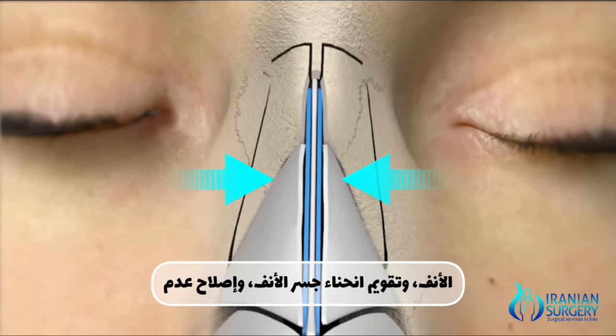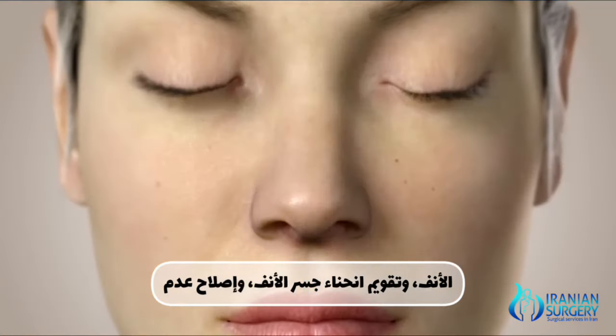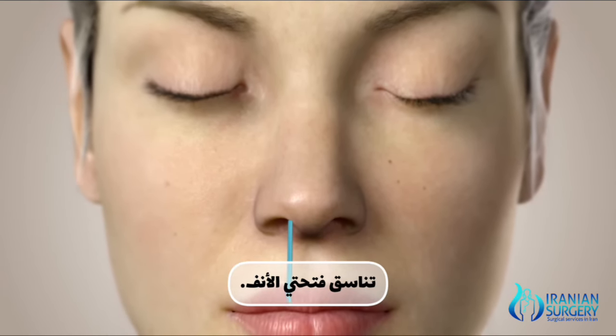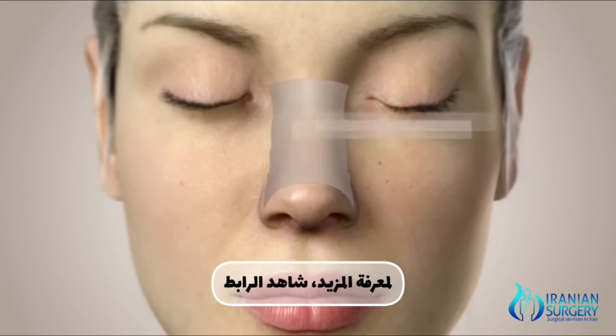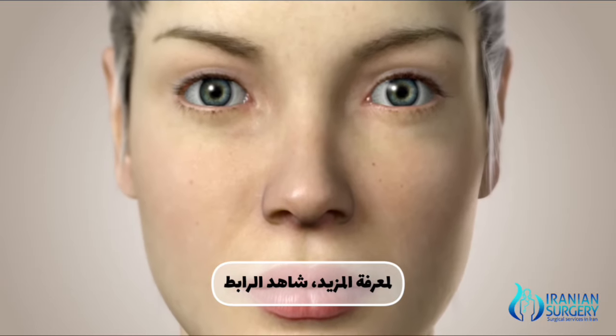Later, the gap in the nasal bridge will be closed by pushing both sides. For supporting the internal structure on the middle line, silicone leaflets will be placed in both nostrils. After the skin-colored special nasal strips are applied, operation will be finalized with placing thermoplastic splint on the nasal bridge.